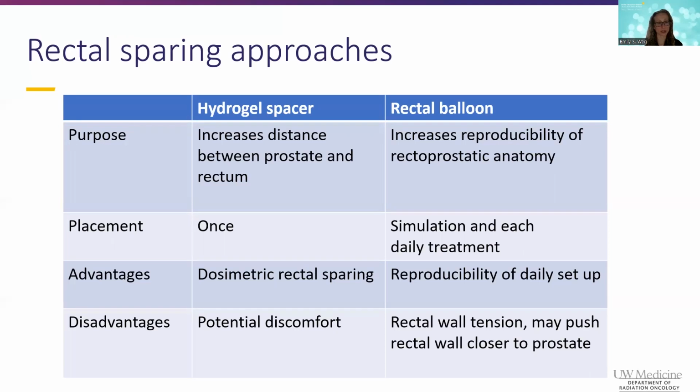The spacer is placed once. The rectal balloon is placed at simulation and every daily treatment. The advantages of the rectal spacer, the hydrogel spacer, is in sparing the rectum from seeing high doses of radiation. The advantages of the balloon is maximizing the reproducibility of that daily setup.